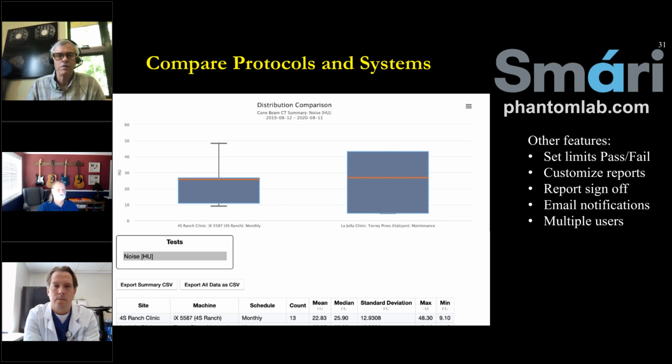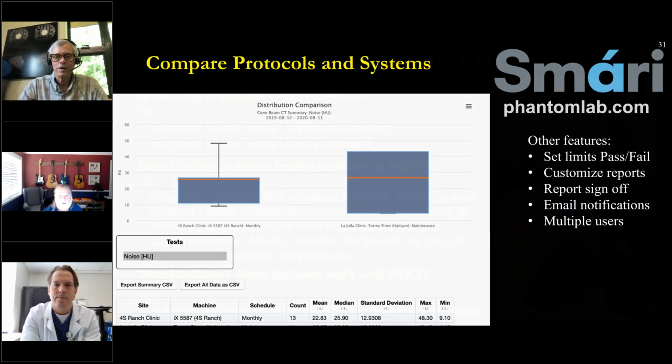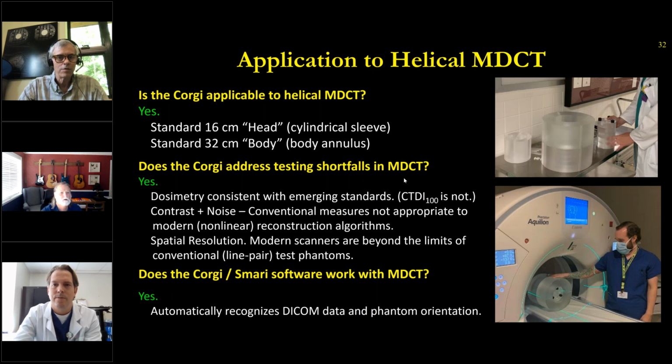And along with, if you have several machines yourself, with this comparative function, you can compare your 3 different brand X dental CTs and see if they're all performing the same on their noise or MTF or whatever features you're interested in. Thanks, Josh. So that's our presentation, I believe. So we're open to any questions.